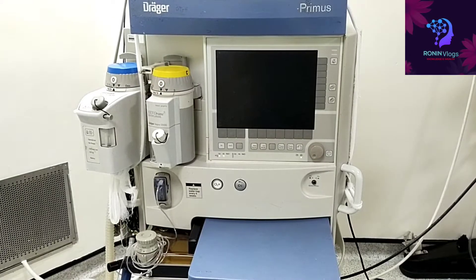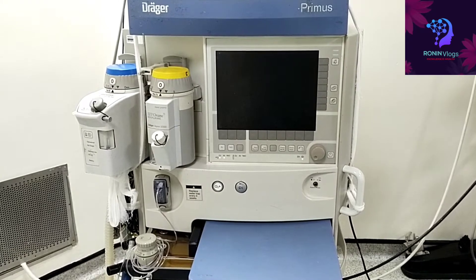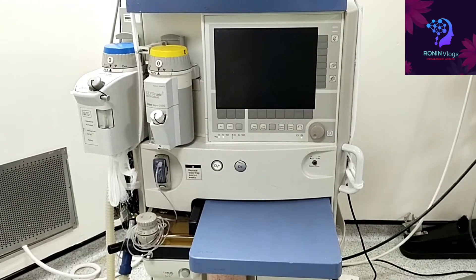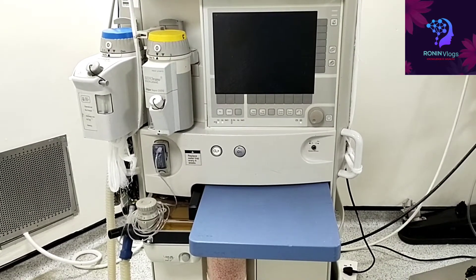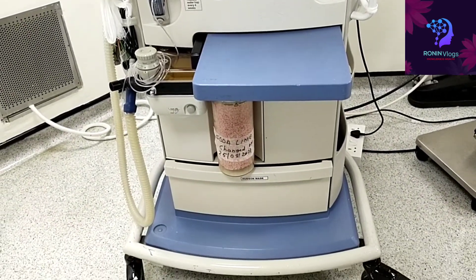Hello friends, welcome to my YouTube channel. Today in this video I am going to show how to do self-test in the Dräger Primus anesthesia machine. This is the Dräger model Primus anesthesia machine.